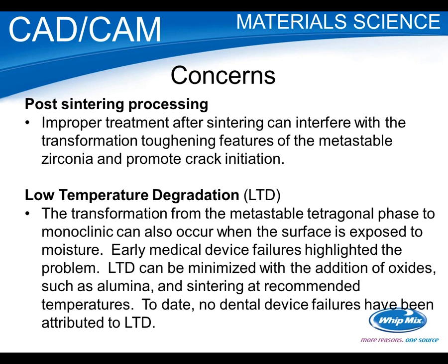You'll see that the zirconia used now for medical and dental has alumina in it, and that helps minimize the low temperature degradation. But I'm going to hit on this again because we'll see that in our processing we can also worsen this. Now, I do want to make a note that it depends on who you talk to how severe this is. If you talk to some of the experts, and especially the experts that went through a terrible time with failures in patients, they are very sensitive to this issue. And when we look at the higher translucent brands of zirconia for dental, what they've done is they've reduced the amount of alumina. And so your experts are kind of concerned with that. But other experts point out that there haven't really been any device failures.